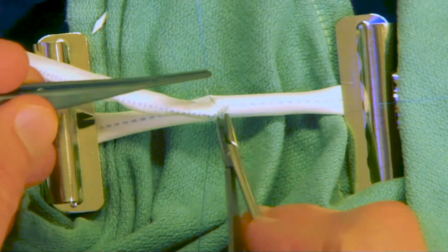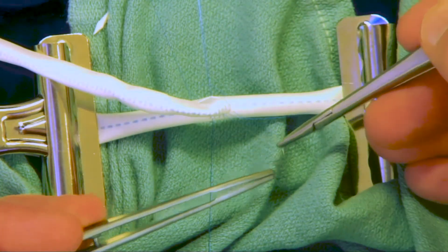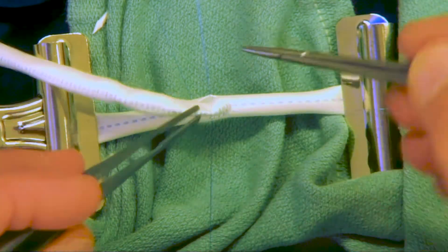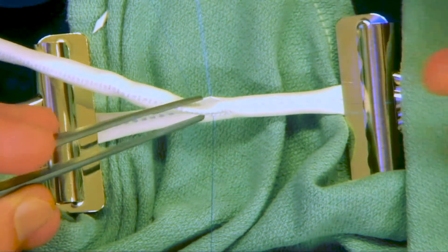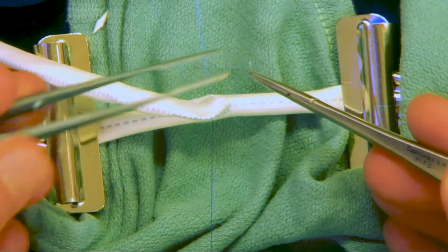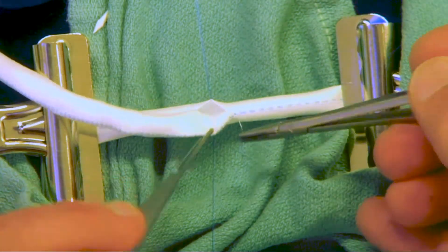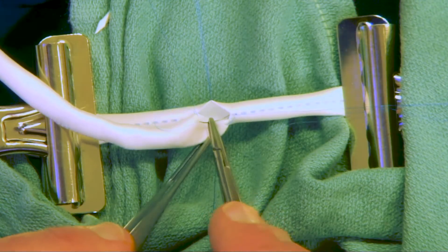As we come around to the opposite corner, it's important to distract the two ends of the grafts so that we can see where we're suturing very carefully and to carefully adjust the needle as we go back and forth. At times, going backwards and forwards between forehand and backhand will make this easier to suture properly with the best bites. You don't have to grasp the edge of the vessel each time to see the vessel and have proper orientation and proper retraction.